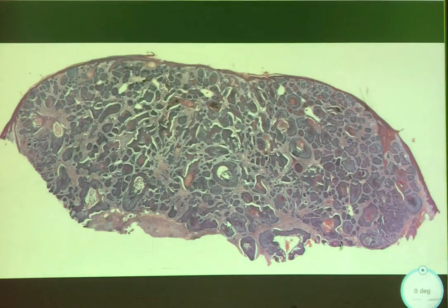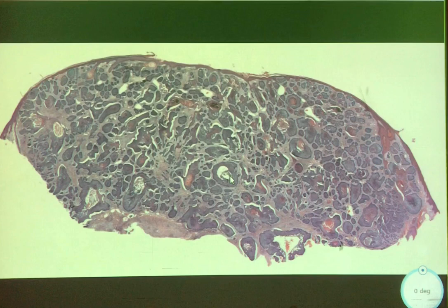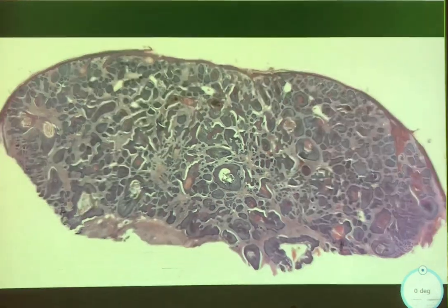Wow. There are so many nests there. So what's the most prominent color on this? Blue, dark blue, purple. Okay, I'll let you say purple because purple's the best color. But so it's very dark, right? Very actively growing. Okay, now I'll let you zoom in.